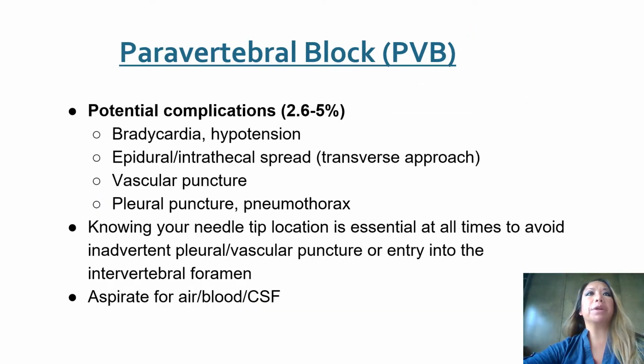Complications can arise from paravertebral blocks from inadvertent epidural or intravascular injection or pleural puncture. So it's very important to always know where your needle tip location is on ultrasound, as well as always aspirate for air, blood, or CSF prior to local anesthetic injection.